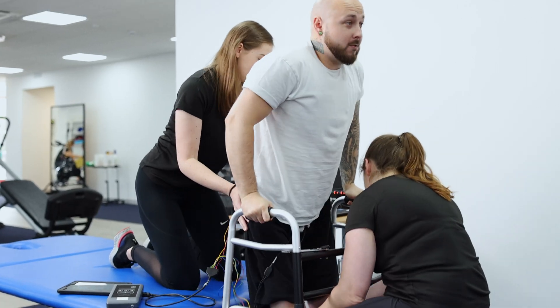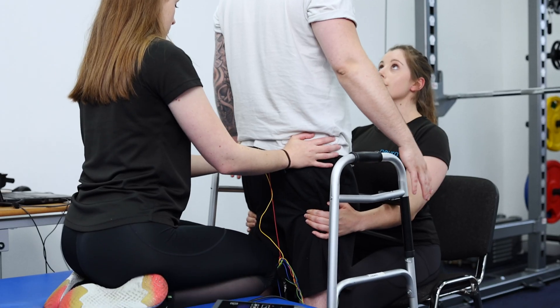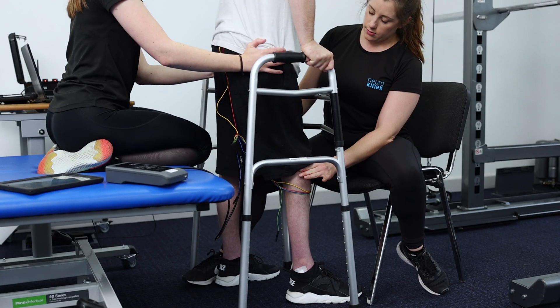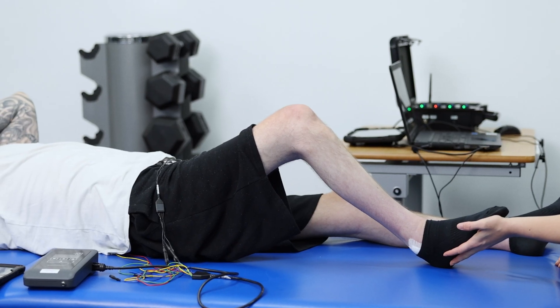This study lasts for 120 sessions spread out over a year. Participants who have completed the study at this point are seeing changes in their motor function — their standing ability, walking, and core control — as well as sensation changes and changes to their autonomic function, including bladder and bowel function.